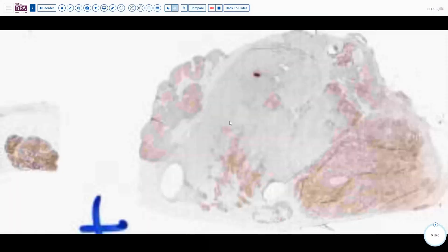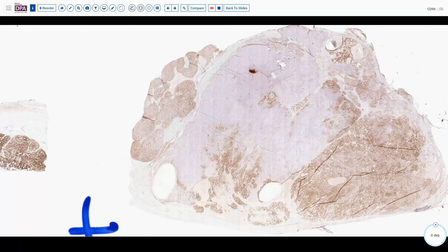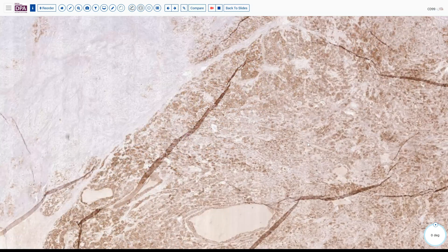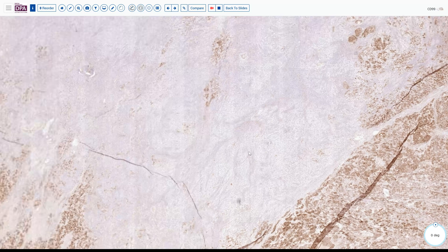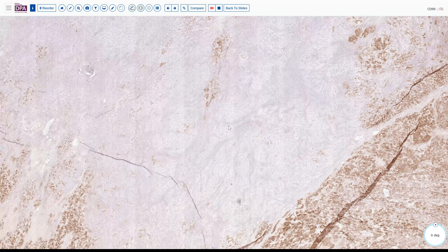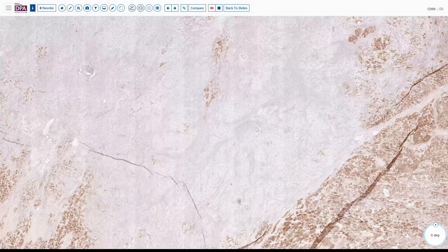If we look at another marker, CD99, on this same section, we see quite a bit of differential expression — nice positive expression in one component but virtually no expression in another component. This kind of pattern can give us a clue that there is some heteromorphism or perhaps some divergent differentiation, helping to qualify the tumor as a mixed sex cord stromal tumor.